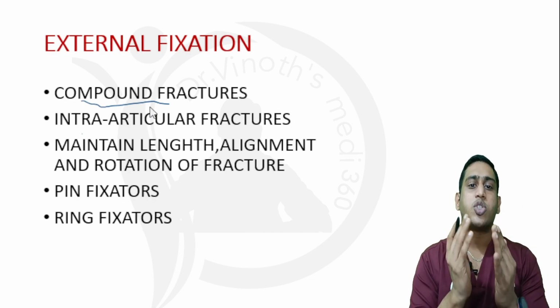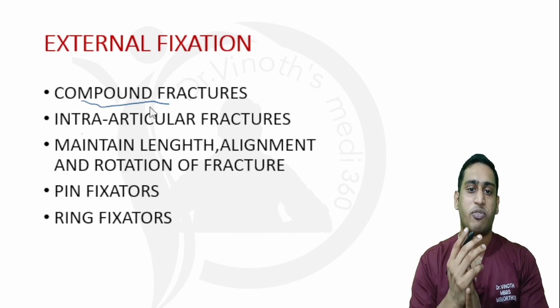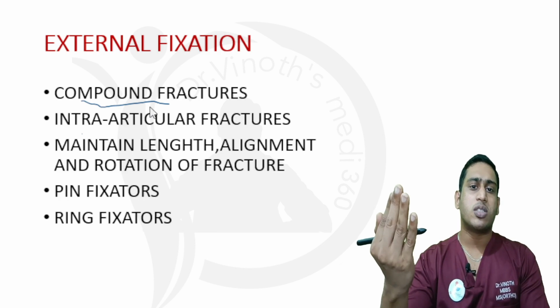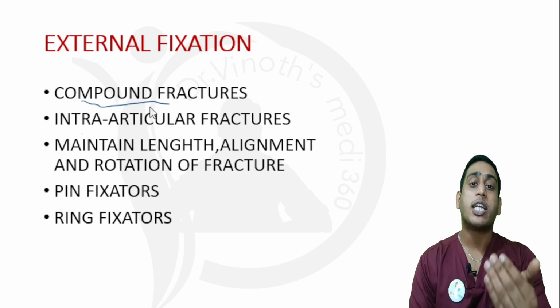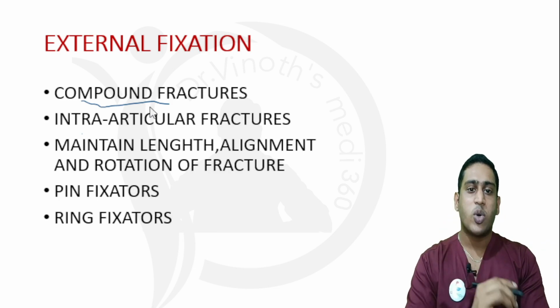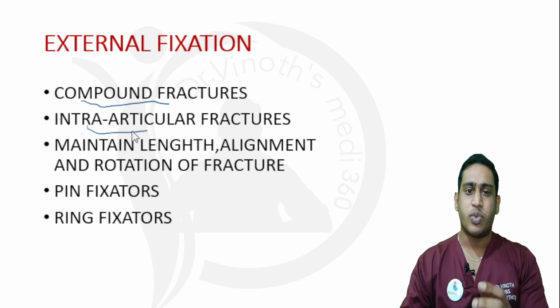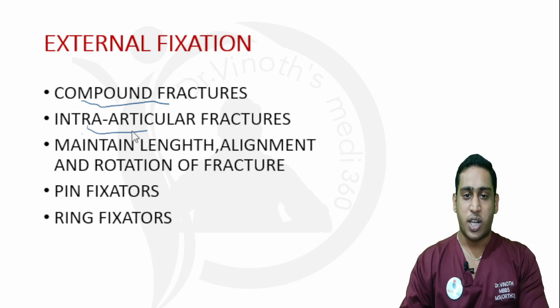Then even when there is no compound wound, if the patient's condition is not fit for a major surgery, at that time we can do a temporary fixation with the help of the external fixators. Then we can postpone the surgery by 4 to 6 weeks, once the patient's condition improves. So for temporary fixation of fractures, even when there is a closed fracture, we can go for an external fixator. Then for intra-articular fractures, whenever there is a more comminuted fracture at the articular surface, we can go for a joint spanning external fixator.